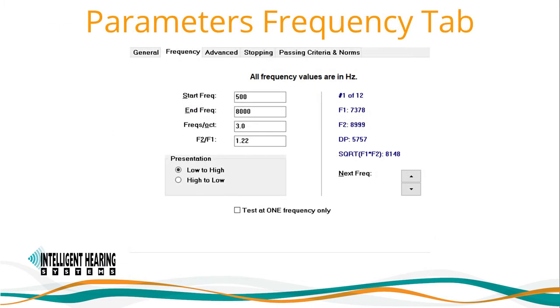When using automated frequency mode, the second tab of the parameters menu will be labeled Frequency. Here you can enter your starting and ending frequency, as well as frequency per octave and your F2/F1 ratio. The software will automatically calculate your frequency pairs and expected DP as shown on the right-hand side of the dialog window. You can also choose to present test frequencies in low-to-high or high-to-low frequency sequence.